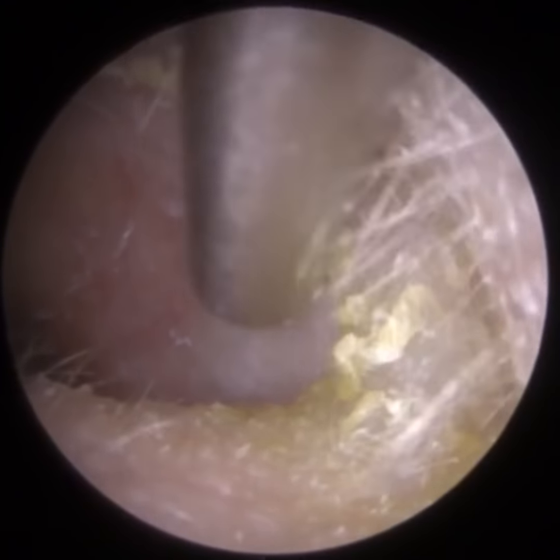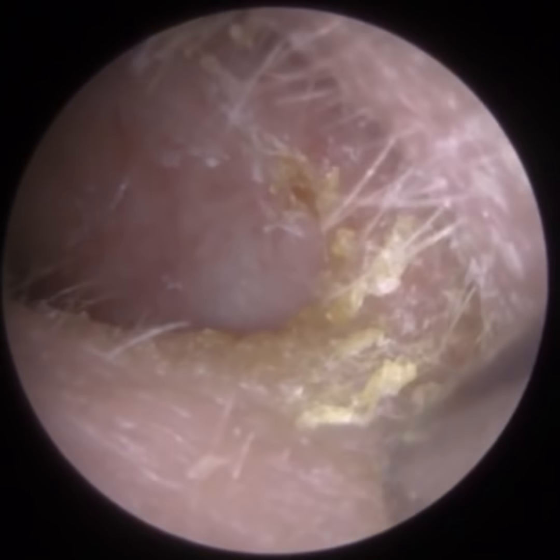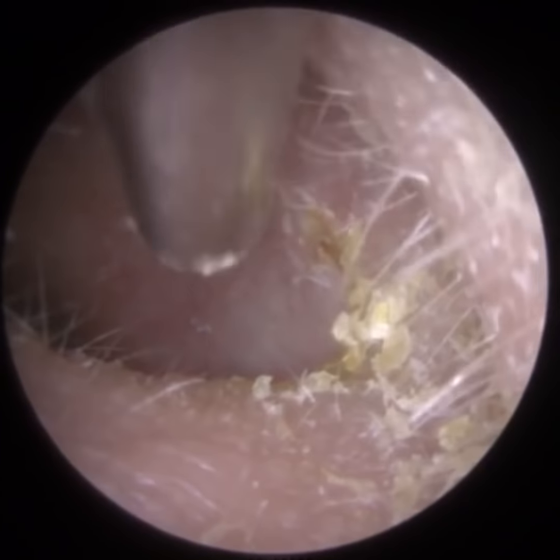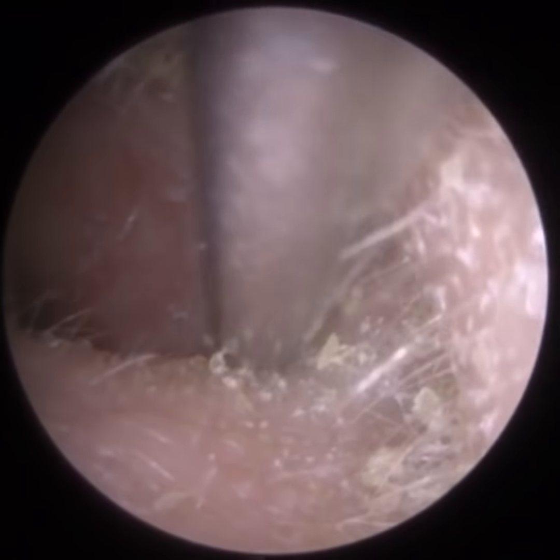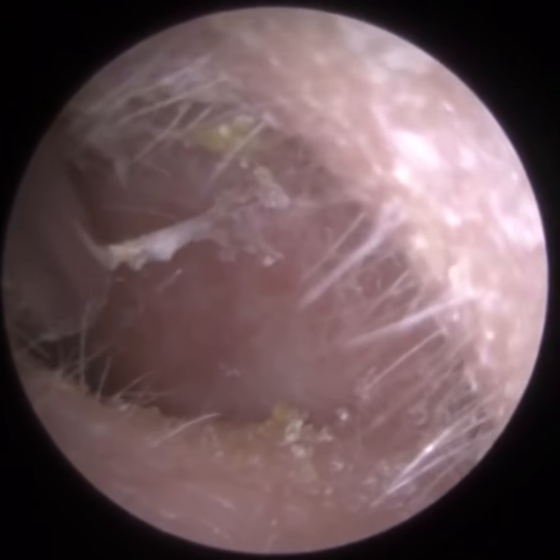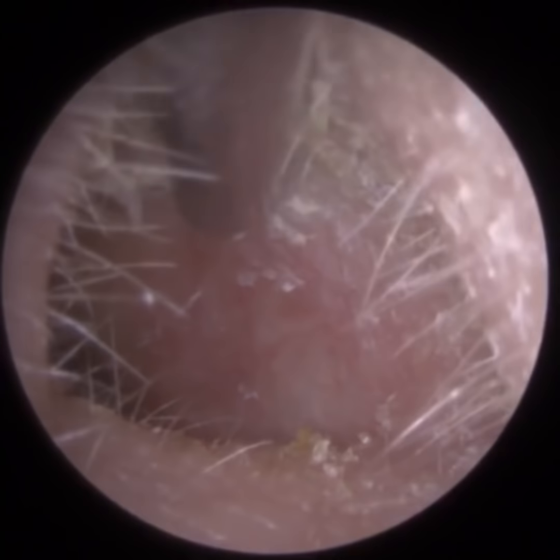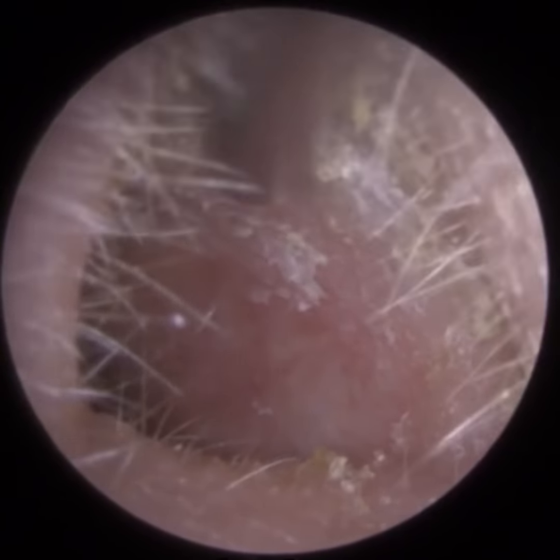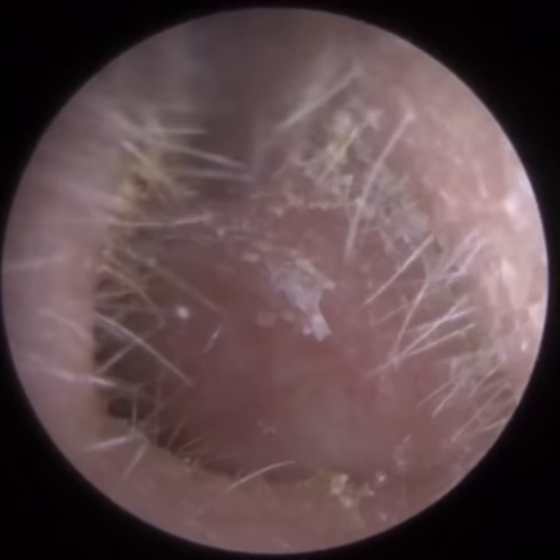As you scrape the skin yourself, if you put too much pressure, you can obviously abrade your ear canal. As that, the healing process itself can be itchy, so you're going to be itching your ear again. When we're removing it, we're just removing the outermost layer of dead skin. And patients enjoy it because there's parts of the ear that if they do itch, they can't reach themselves.